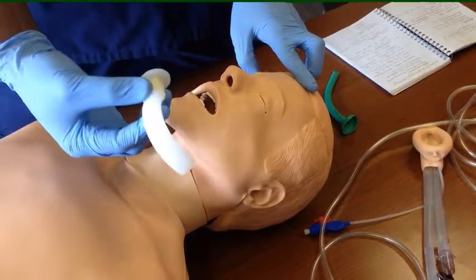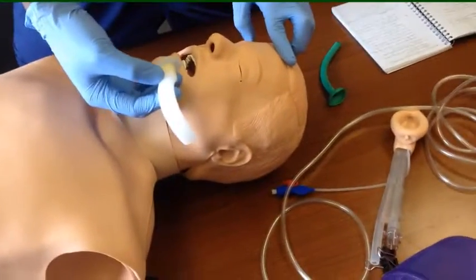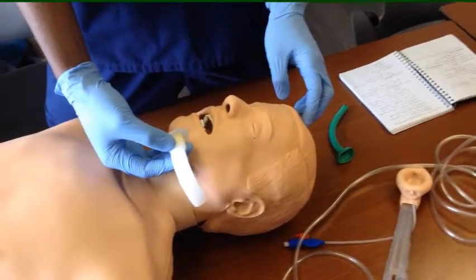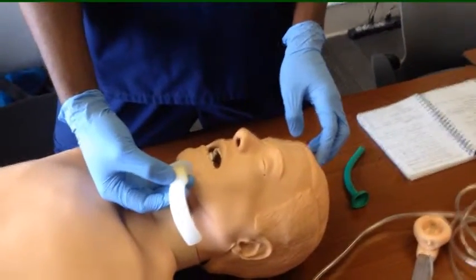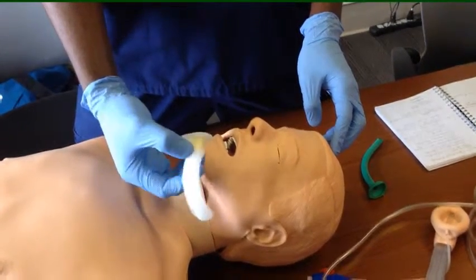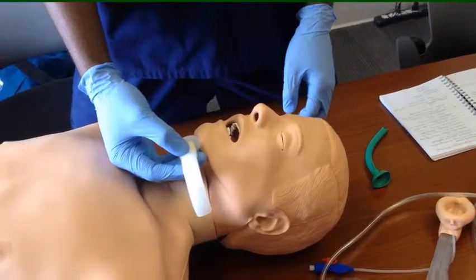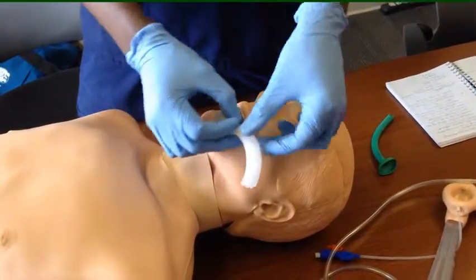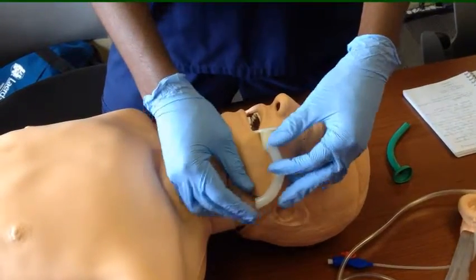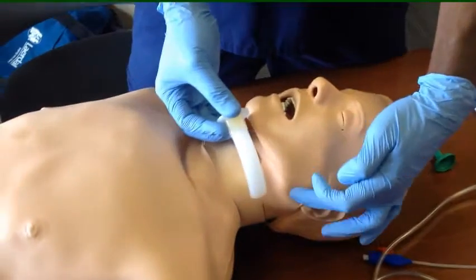that's when we use the oral pharyngeal airway. And they come in different sizes, and before you use it on a patient, you really have to make sure that you have the right size of the OPA you are using. The only way you can know that you have the right size is you have to measure from the corner of the mouth to the angle of the jaw. So that means from the tip of the mouth to the angle of the jaw over here.